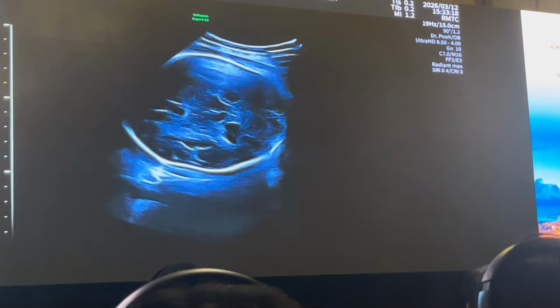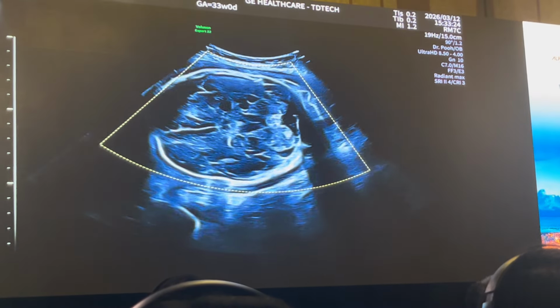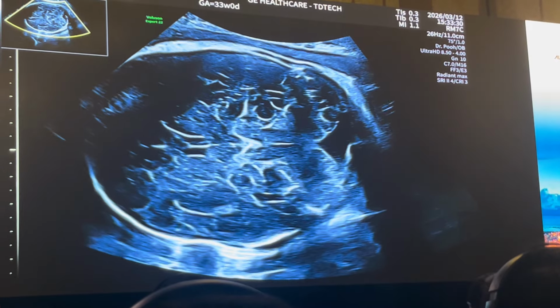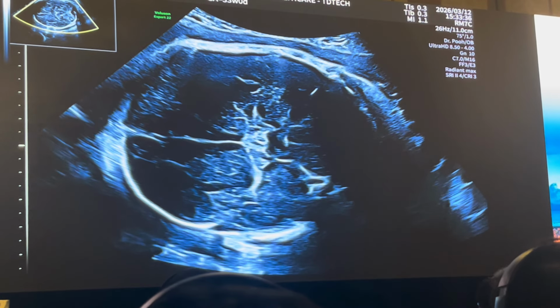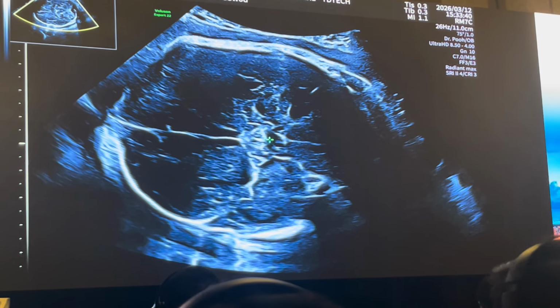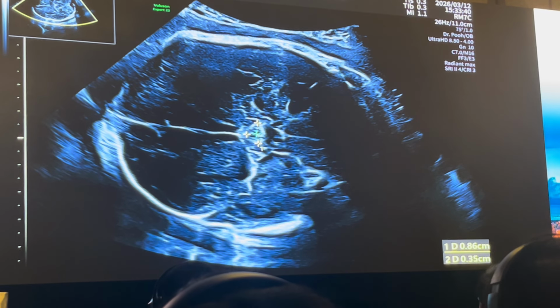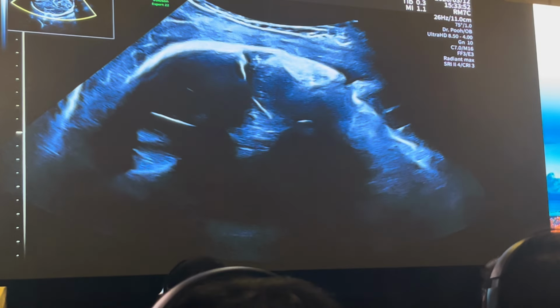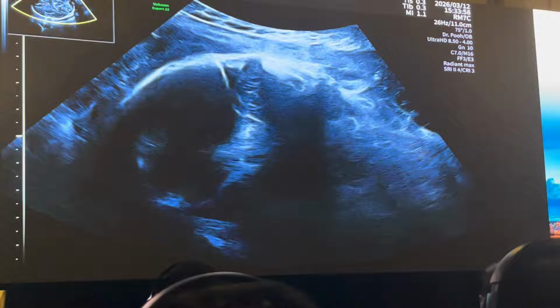But most of the audience maybe think that the optic chiasma is like the Chanel sign, the X and the X. However, only the posterior part of the optic chiasma is seen. And that's the point that Mitsuko is making, which is very relevant. We're just seeing the posterior portion of the optic chiasma. To see the anterior portion is very challenging, in which you try and bring the orbit and the optic nerve into view, and sometimes you may rely on the vaginal scan.